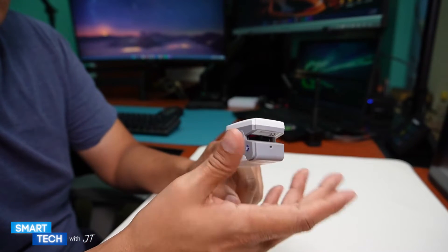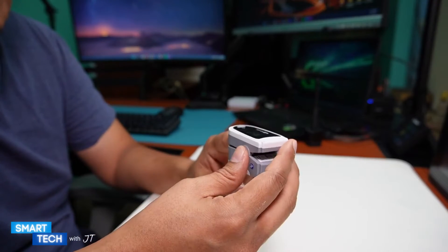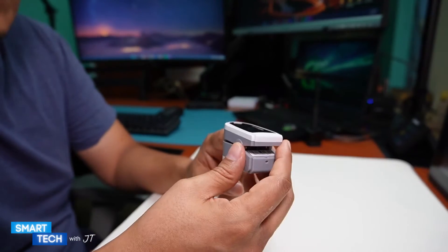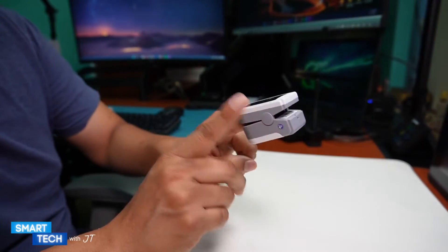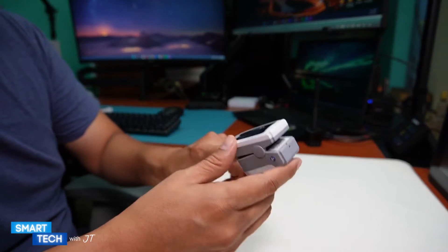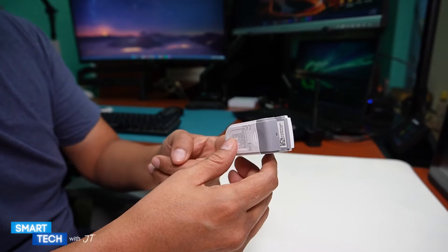If you're looking to use it for sleep apnea, it may help you register data, but you still have to go to a doctor for that. You're going to need to place a gauze or tape on it to keep it secure.